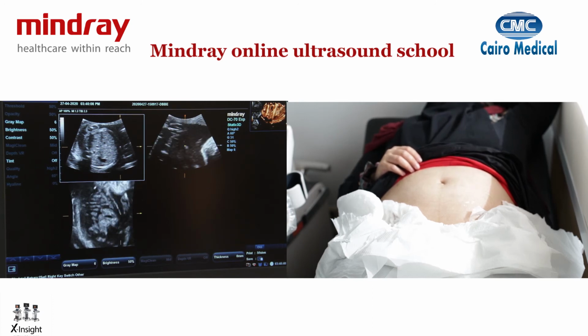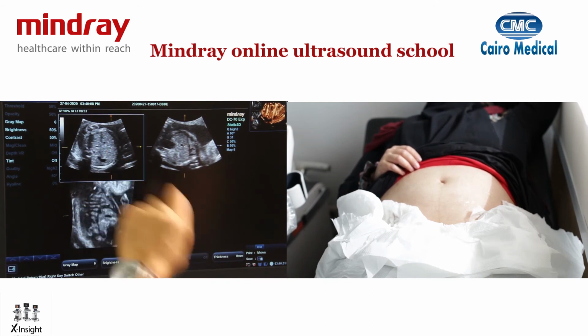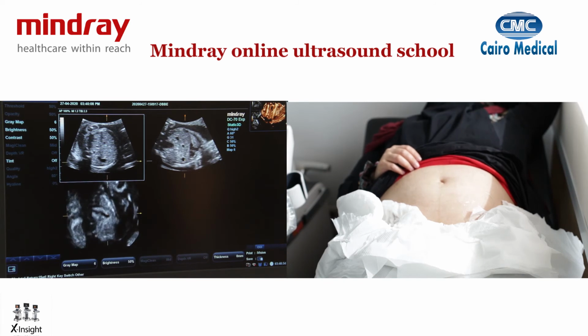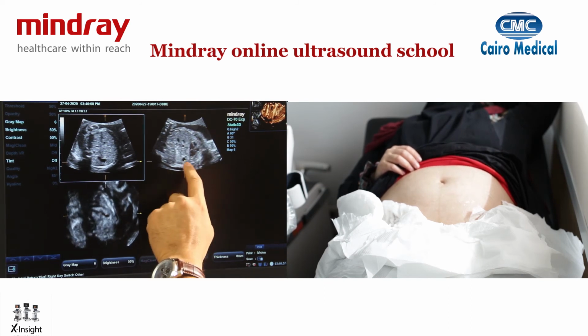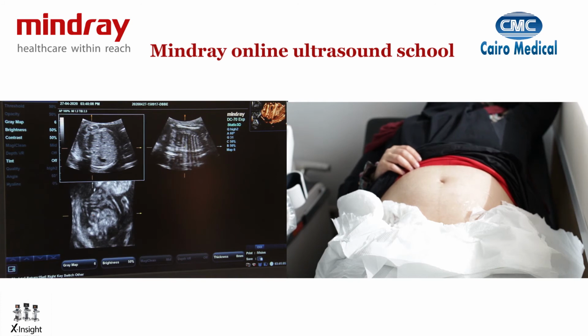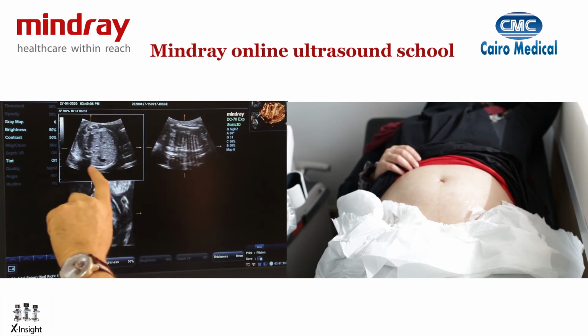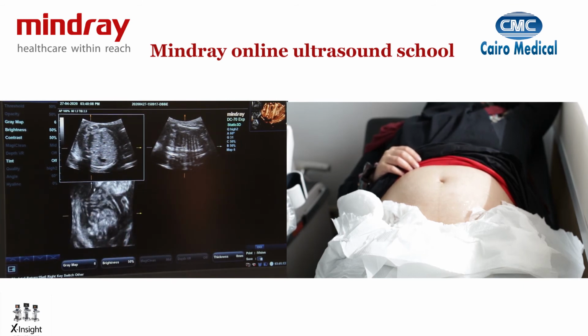So if you move this way, for instance, I'm coming very close to the surface where I can actually see the cord insertion at one point. If I go backwards, then I'm moving across the abdomen. Here, I'm seeing the liver, which is what I'm scanning with my point of interest. If I want to go towards the stomach, I can see the stomach, and it's on the left side below the heart. If I go back to the midline, and I keep sweeping backwards, I'm seeing the terminal ends of the ribs, which are in the back here, what you see in the abdominal circumference. And if I keep going downwards toward the spine, then definitely the back part of the spine and the kidneys will be seen.